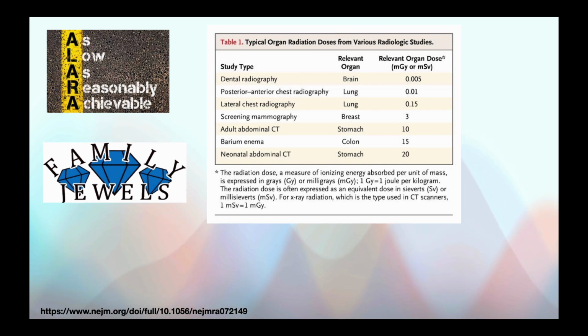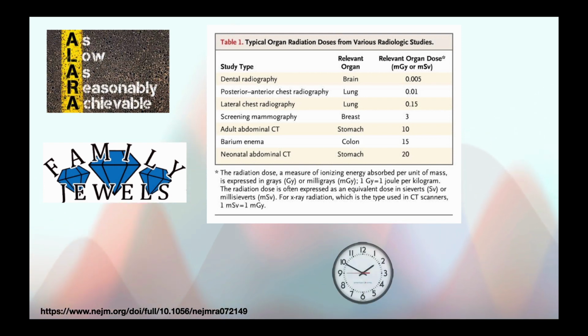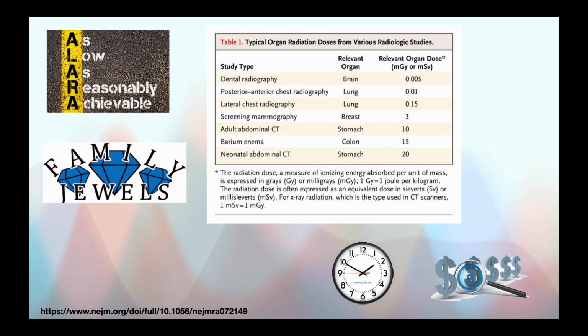Ultrasound avoids this issue because there is really no ionizing radiation. Now, there are other things that are associated with heating of tissue with ultrasound waves, but that is much less of a risk than with ionizing radiation from either plain films or CT scans. Now, there are other considerations. The time it takes to order and perform a radiology ultrasound or CT or MRI can mean an additional few hours in the outpatient setting or even a day or two if the patient is admitted. And not to mention there's also the added costs.